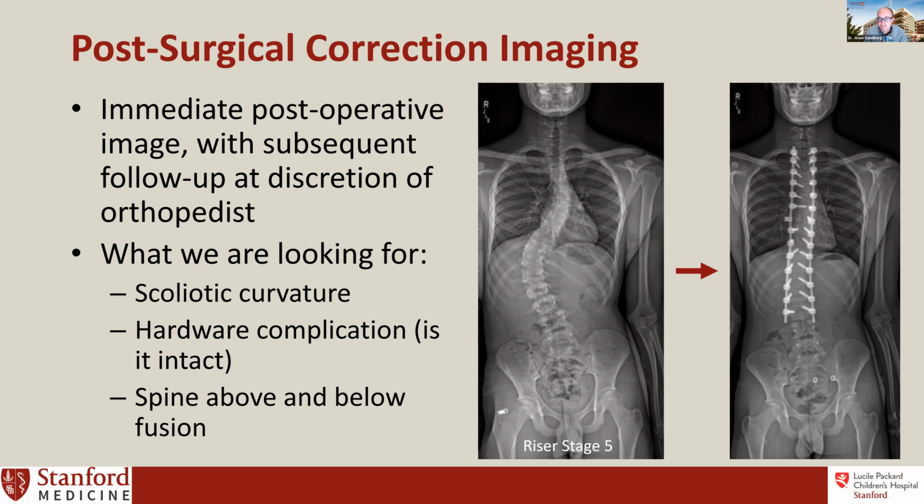Good. How about this one? Another question, John: when taking stress films in the brace, how long should the brace be off before in and out of the brace? Maybe a nuance, and I don't know, Jesse, if this is more of an X-ray tech issue, but if you have any thoughts on that. That sounds like a tech question. That's a very good question though.